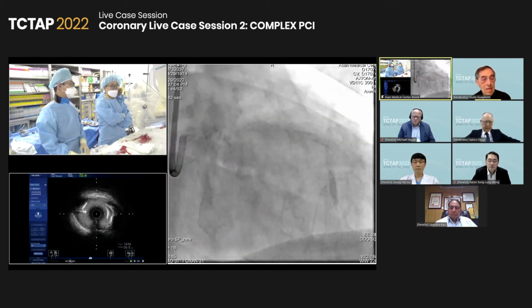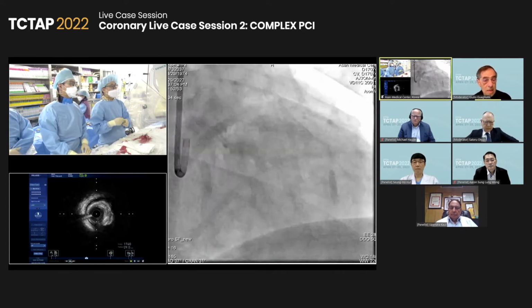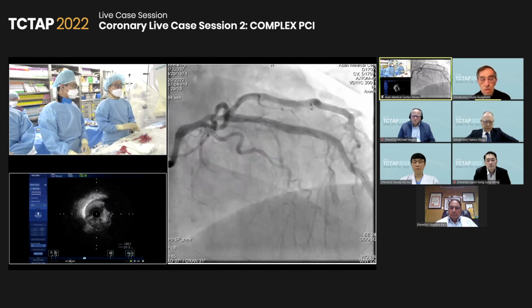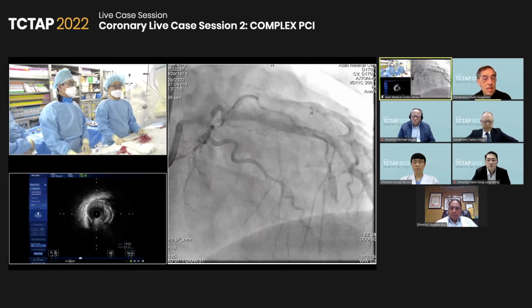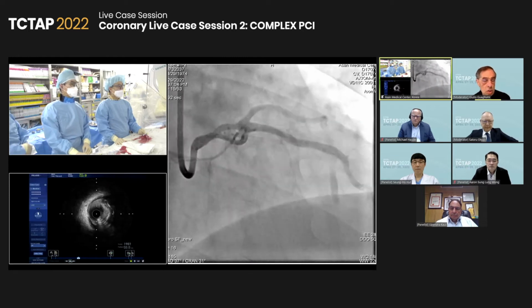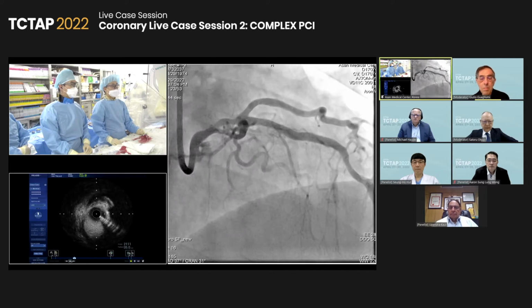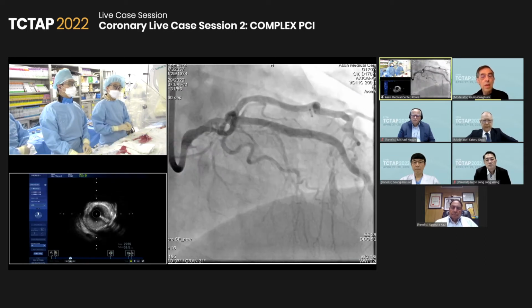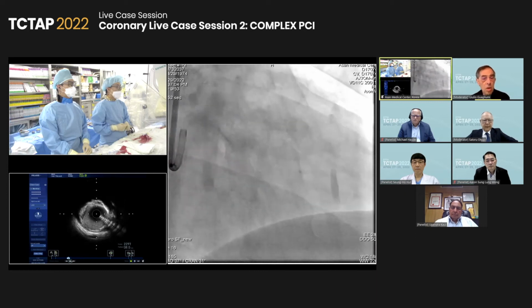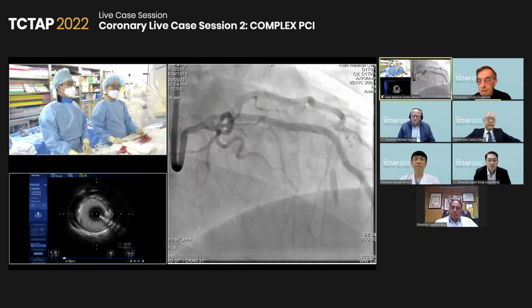The risk is more toward embolization compared to underexpansion. The last information is very important, and I would like the panelists to comment. The lesion is going up to the ostium of the left main. You might still have some plaque near the ostium. So instead of saying we are landing in the mid body of the left main, we need to go a little bit further.